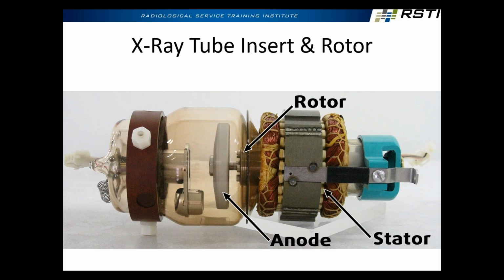He's like, well, oil's supposed to be in there. So he asked the tech, have you done anything? They said, no, it made a noise and we knew something was wrong, so we just called. So he walked in there and looked at the table again and looked at the tube very, very carefully, and he could see a very fine crack in the housing of the tube. And then he turned around and looked at the opposite wall, and there was a hole in the wall with this profile.